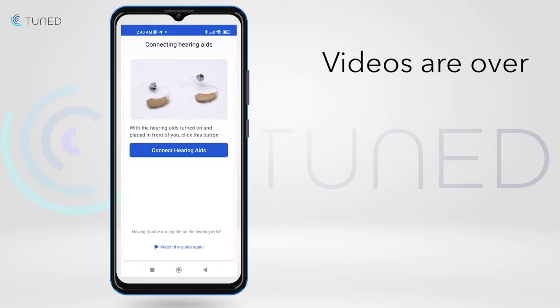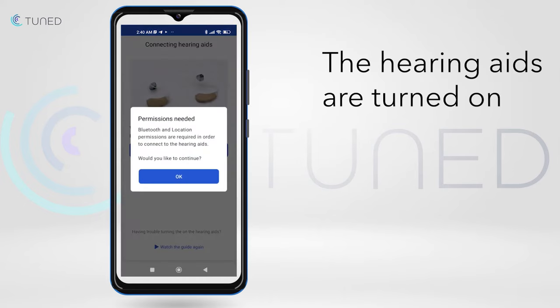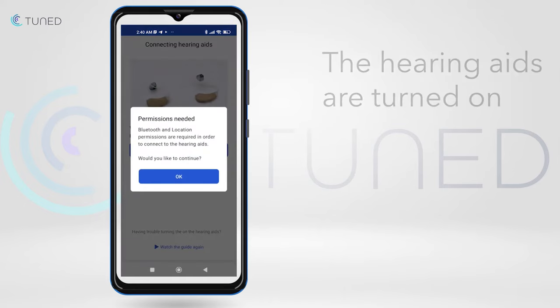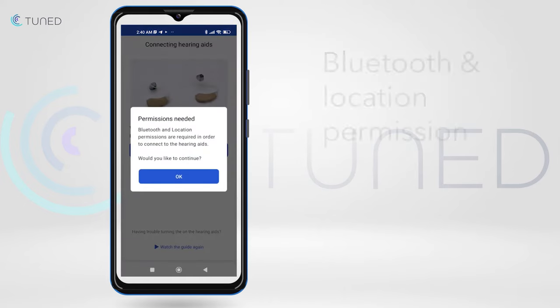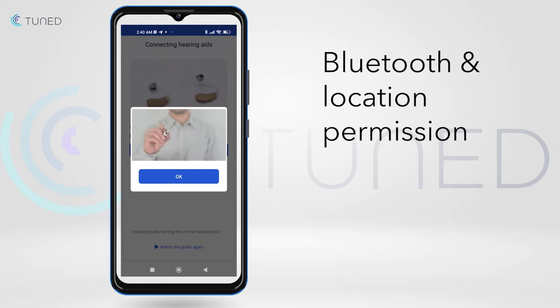Once the videos are over and the hearing aids are turned on, the app will request the user's permission for Bluetooth and location connectivity. These permissions are vital for the hearing aid pairing to the cell phone.